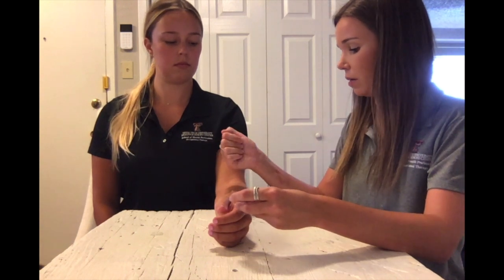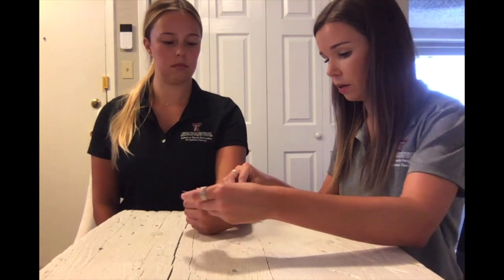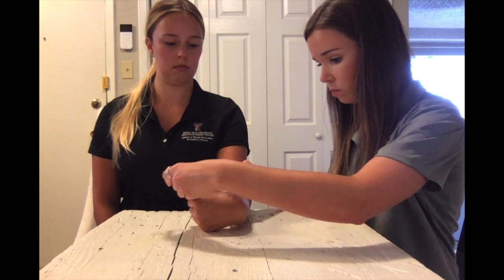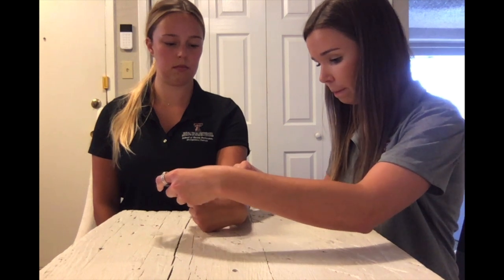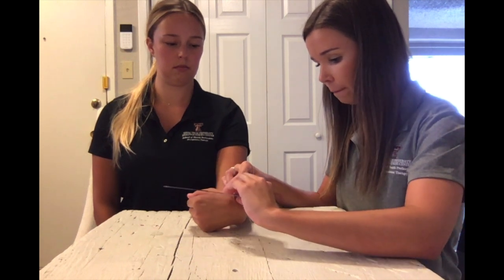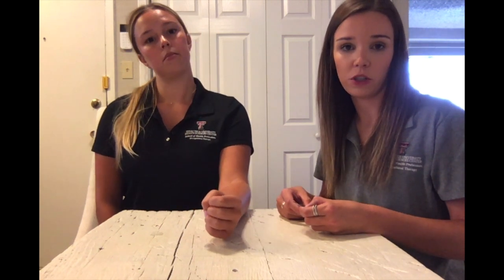Addison, I would like you to bend your wrist forward for me. Addison has 85 degrees of wrist flexion. The normal range of motion for wrist flexion is approximately 80 degrees.